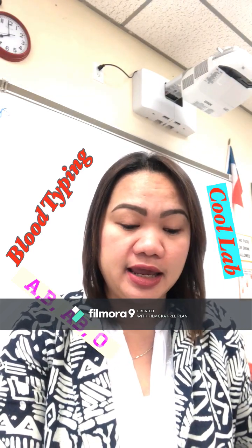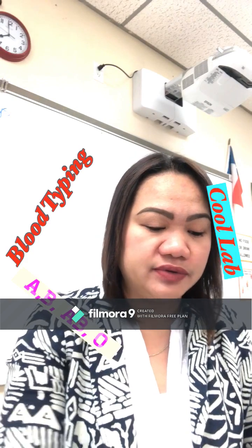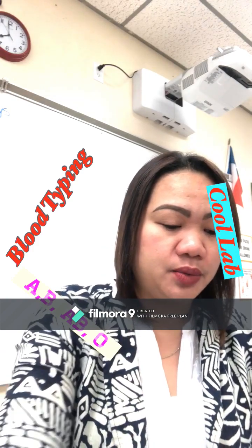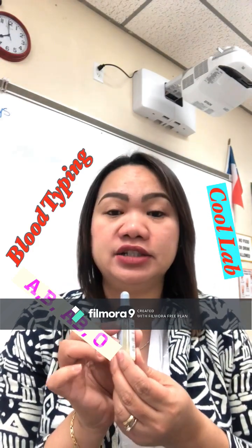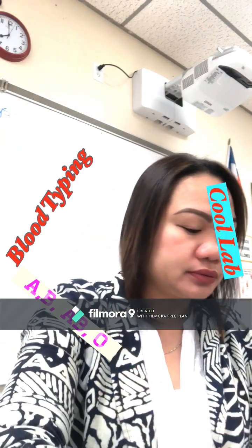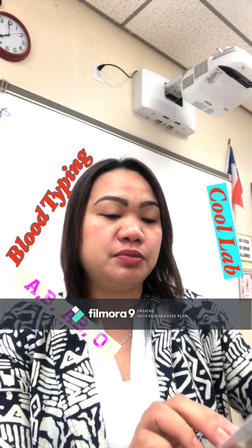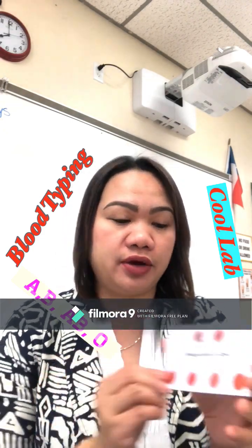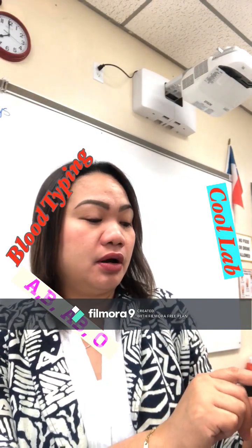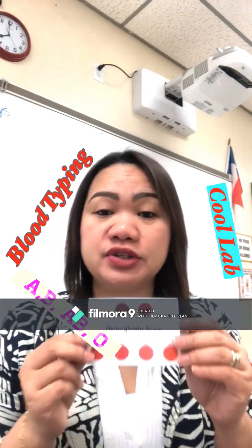To determine their blood types, we are using serum. This serum has antibody A — serum A with antibody A — and we have serum B with antibody B, and we have antibody D, which will determine the RH factor, whether positive or negative. Aside from determining blood types, we will also be determining their hemoglobin scale: whether they are at 100%, 90%, within the borderline of 80 to 70%, or anemic at 60 to 50% hemoglobin level.